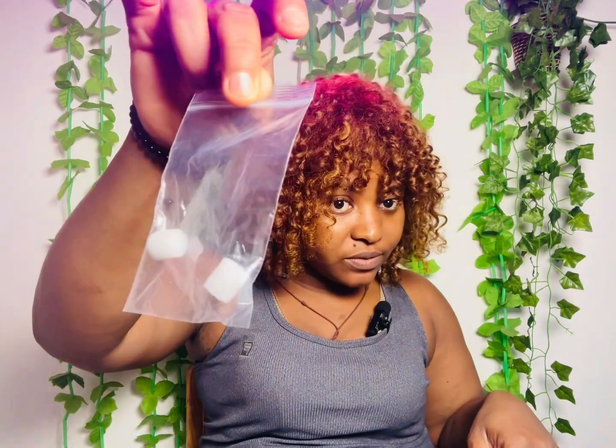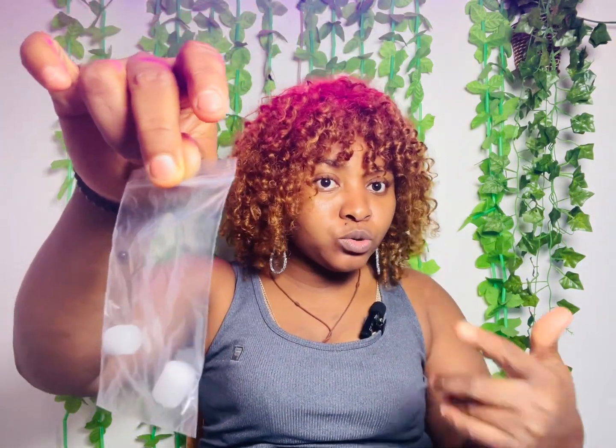Now what I'm going to do here is, this machine comes with an already inserted air filter, so this one is for reserve. It's for when I want to change the one already in the machine. Let me show you. If I'm supposed to change that air filter, I'm going to go over to this place. Like I said, every machine is different. This particular spot might not be where another machine's air filter is supposed to be, but in this machine, we have it over here.